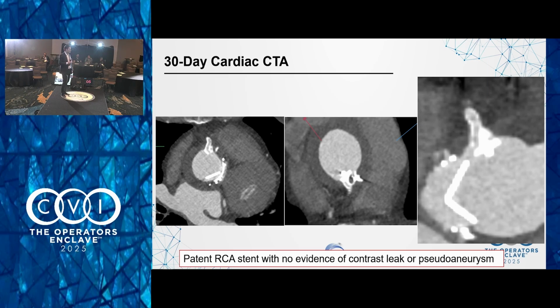You can see the papyrus stent expanding a little bit into the aorta. The plug is right behind it. I put it in the middle, actually. You can see that little C shape that you saw on fluoro. It's actually how it closed off in the CT. I think that little upward facing is what helped us keep the RCA free, and it helps you maintain a nice compression and a nice closure there. You can see the RCA is filling pretty nicely. So she's doing well, chest pain free, no issues, normal EF, patent stents.